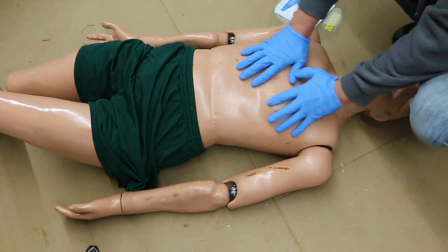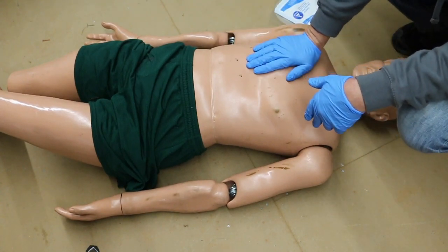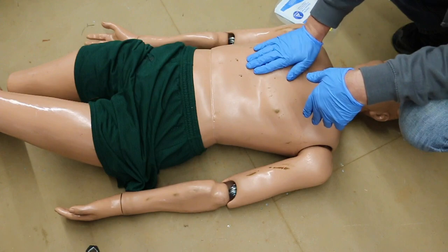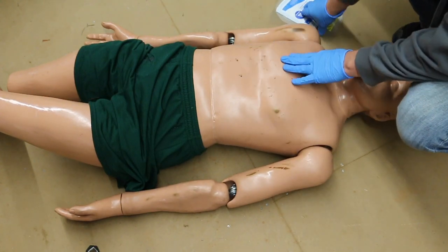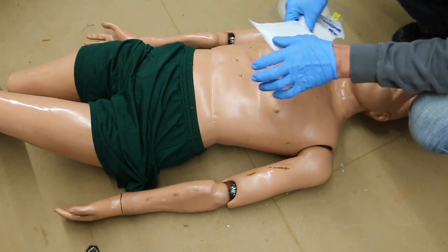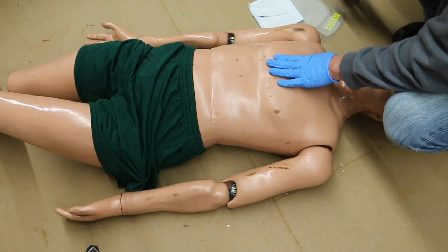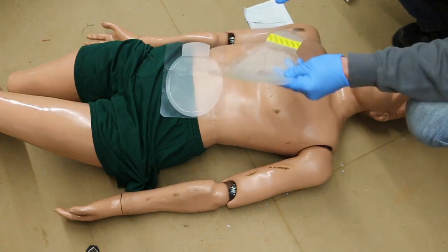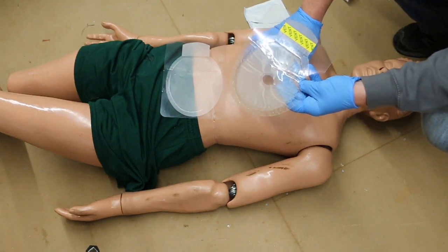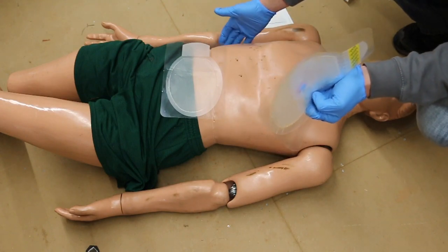So we're looking for any kind of holes in the chest. So let's pretend that my buddy has a hole in the chest right here. Okay? So you could put a gloved hand on, that works as well. If there's any kind of blood coming out of it, we'd want to take a 4x4, 5x9, wipe away any kind of blood so we can get a good seal with our chest seal here. I would use the vented chest seal on the top part here. We're going to roll them in just a second and look at the back side.